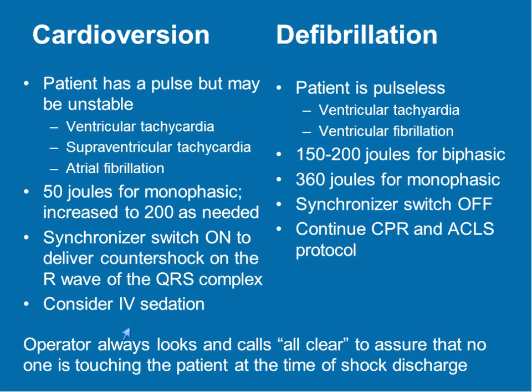In cardioversion, you always want to consider IV sedation. We may not be able to give the patient IV sedation. They might just be unstable enough, and then it's a matter of, you know, the patient's lightheaded, they're hypotensive, and they look really, really bad. You don't want to give them sedation and lower their blood pressure more. It's just, I'm sorry, ma'am, you're going to feel this. We've got to shock you to get that heart out of that rhythm.